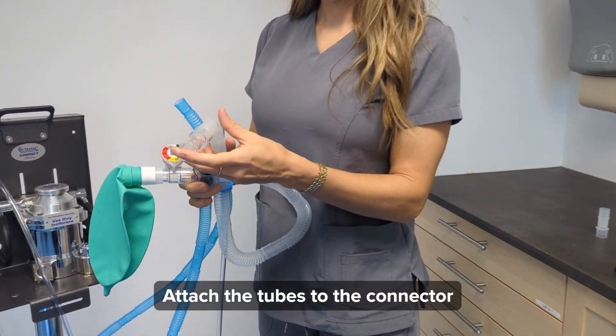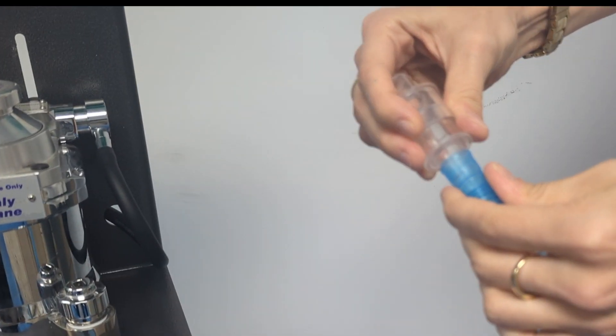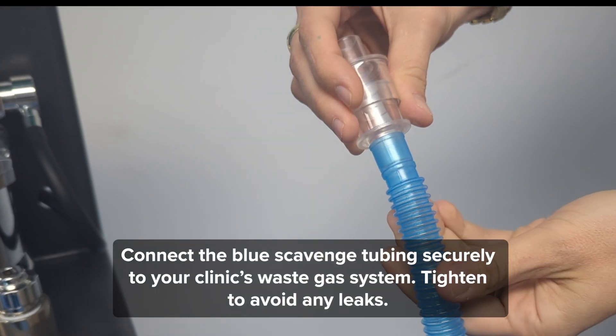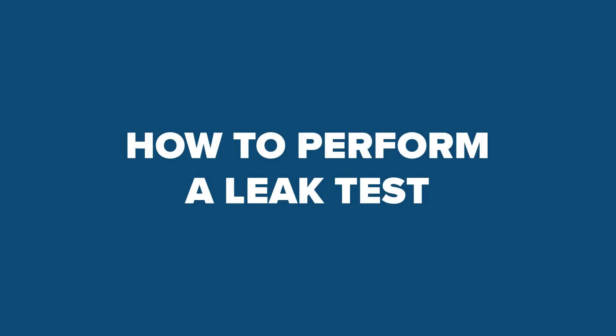Attach the tubes to the connector. Connect the blue scavenge tubing securely to your clinic's waste gas system. Tighten to avoid any leaks. How to perform a leak test.